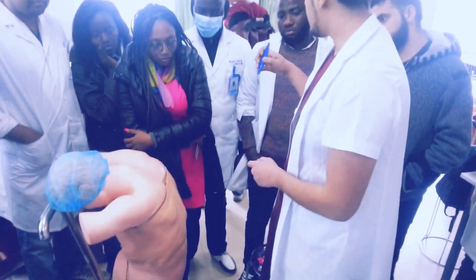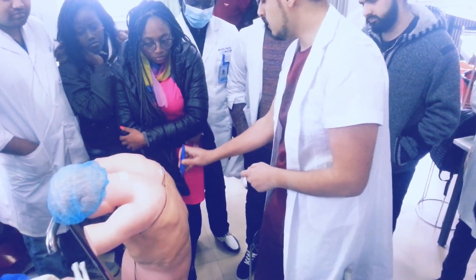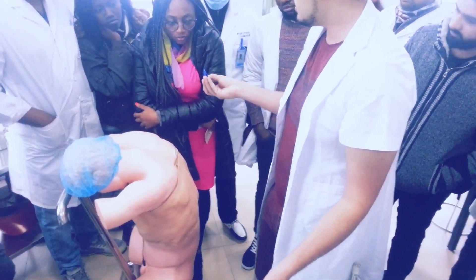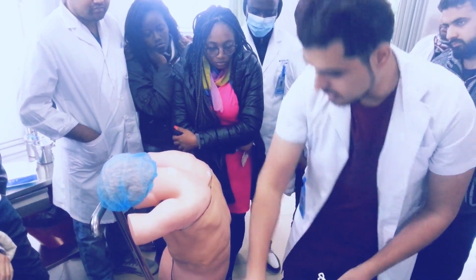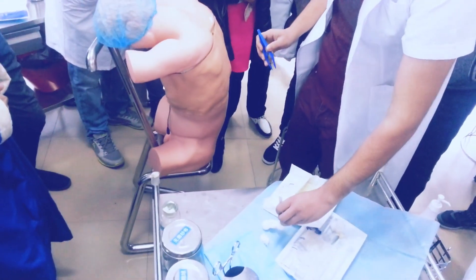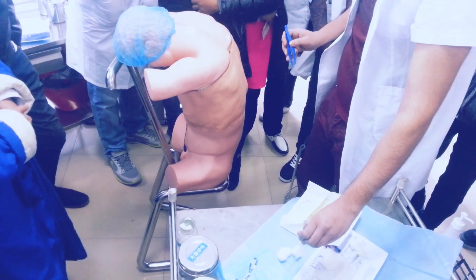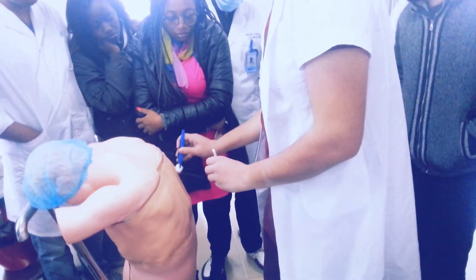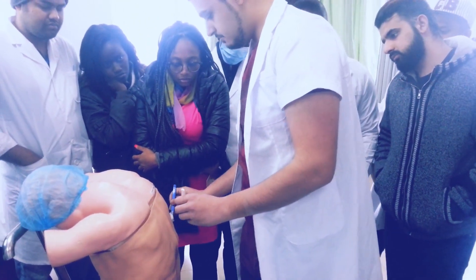Even with this, you hold it like this in a downward position — you cannot hold it any other way. This one is in the disinfected area, so you cannot handle it carelessly. You have to take this with the other hand, and then you do this three times in a circular way. Cloth-wise, mostly.